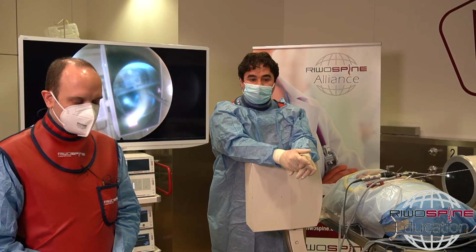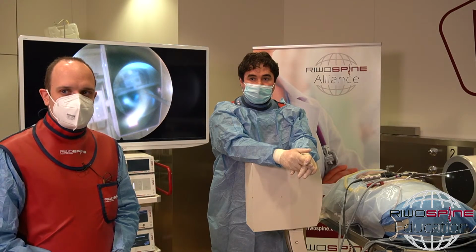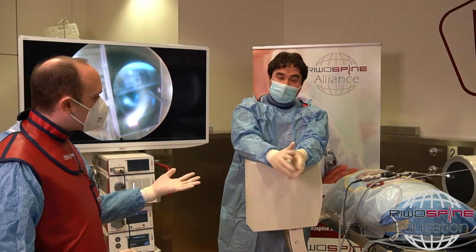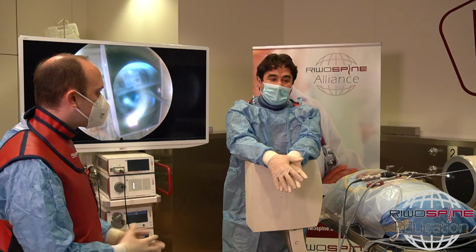You get through the ligamentum flavum very quickly. This is often the most challenging part for new users. So the question is that you go very quickly through the ligamentum flavum, and this is a very difficult part for new users. So what's your opinion?